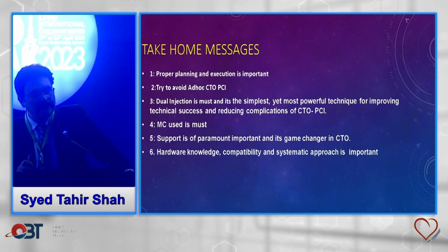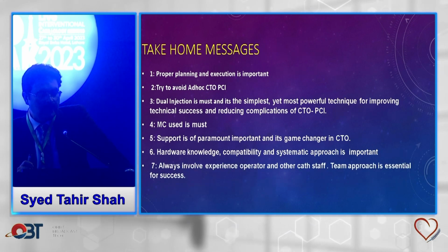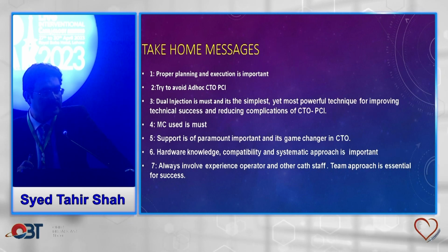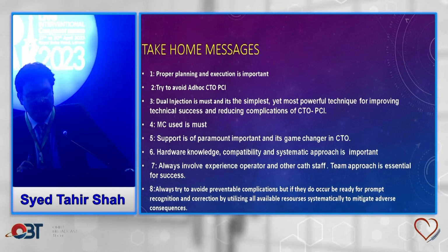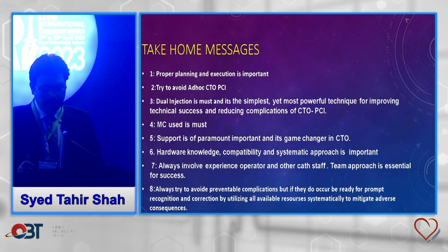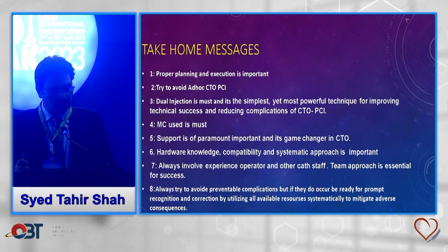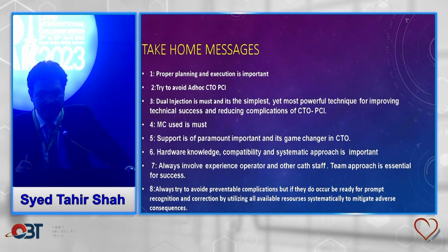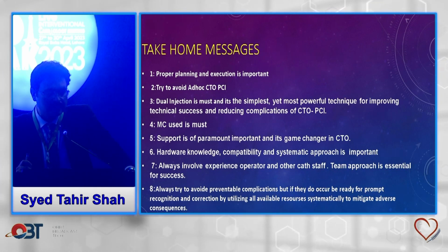Hardware knowledge, compatibility and a systematic approach are important. Always involve an experienced operator and other cath lab staff. Team approach is essential for success. And then always try to avoid preventable complications, but if they do occur, be ready for prompt recognition and correction by utilizing all available resources systematically to mitigate adverse consequences.